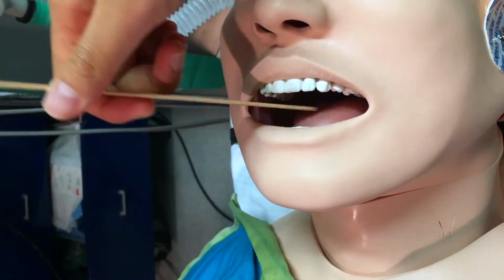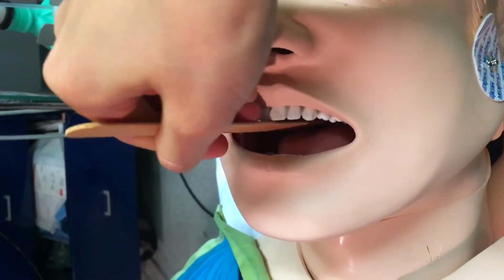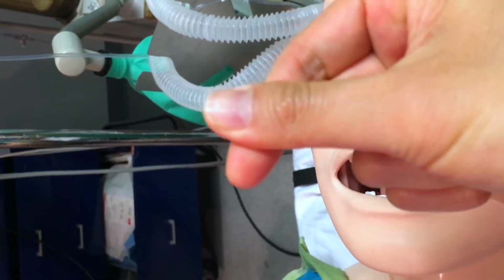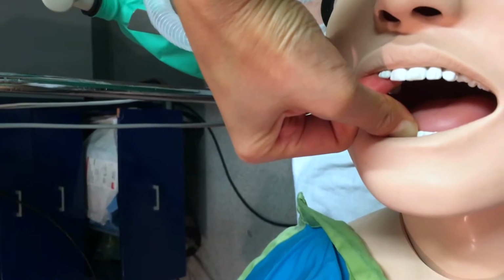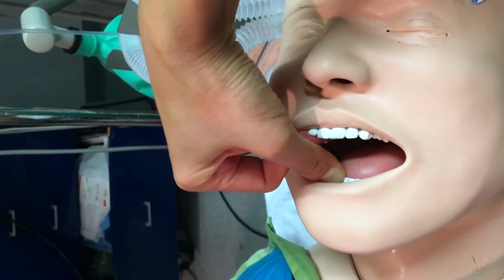Usually the tongue is a big obstruction in a lot of the airway management that we do. So you can use the tongue blade to move the tongue out of the way, or you can do something called a scissoring technique, which essentially you make like a heart symbol and you increase it. So you can scissor like this, allowing for more space for the oral airway to go in.